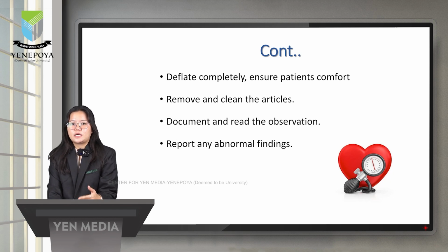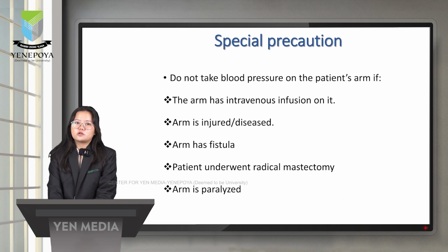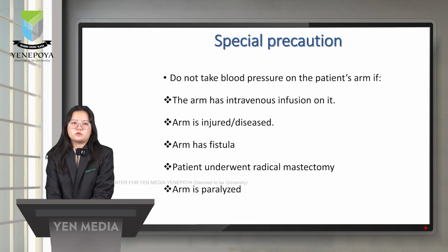After that, we have to analyze the reading. If there is any discrepancy or abnormality that you find, you have to report it to the physician. So that was the procedure of BP monitoring. Now we have to see some special precautions that we have to take during BP monitoring.